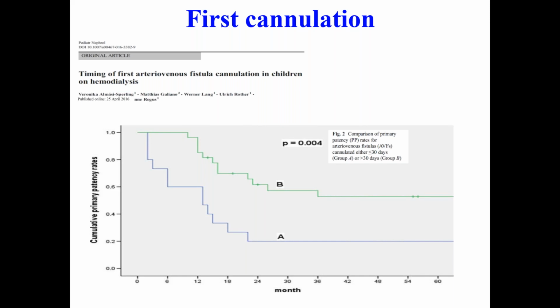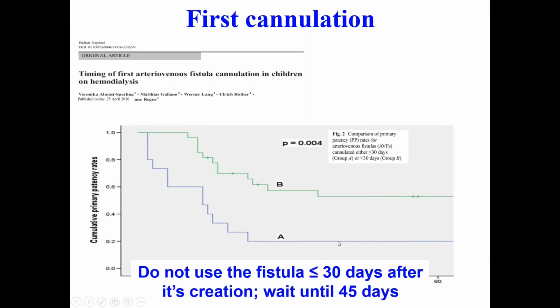But the timing of the first cannulation is extremely important. And this very nice study has shown that if the fistula is needled before 30 days, then the risk of damaging the fistula is far greater than if you wait for 45 days or after for the needling.